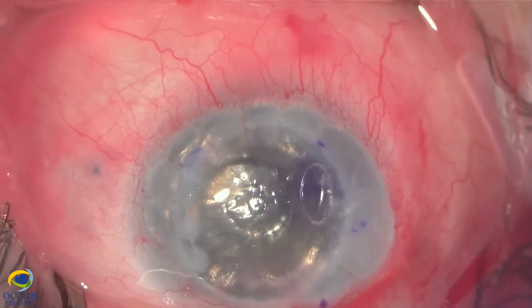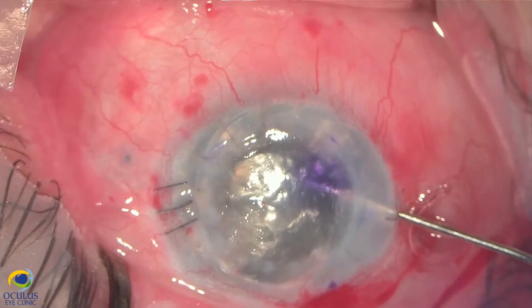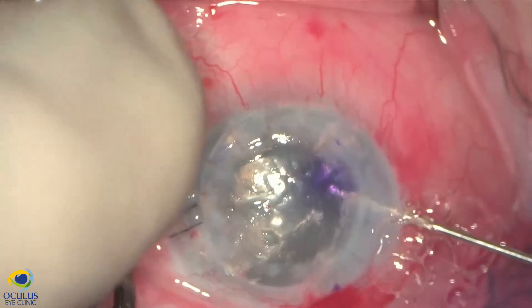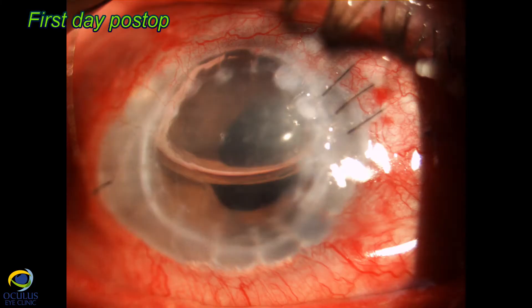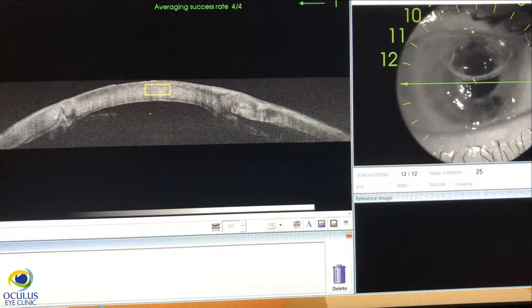At the end, I leave the eye under slightly high pressure, about 30-35 millimetres of mercury. This is how the eye looked on the first day — a very nice-looking cornea with attached lamella, and two-thirds of the anterior chamber filled with air.